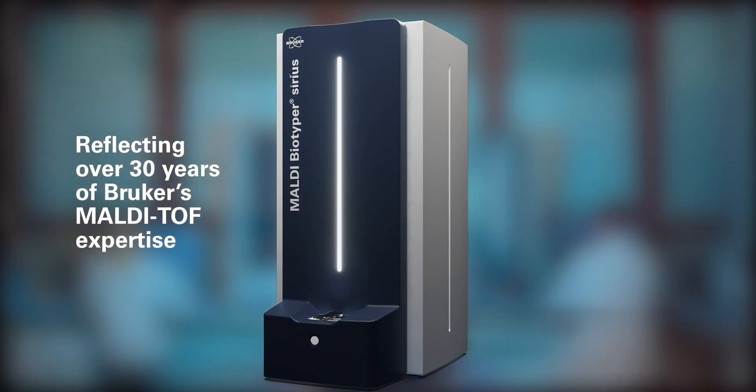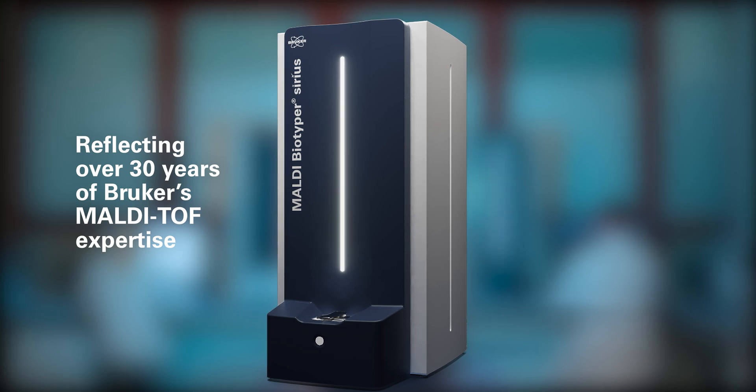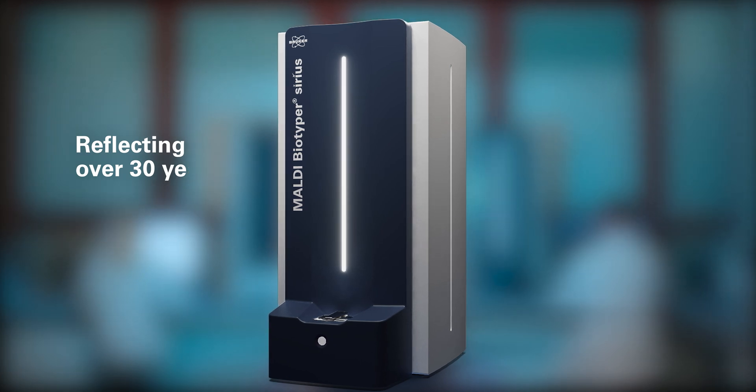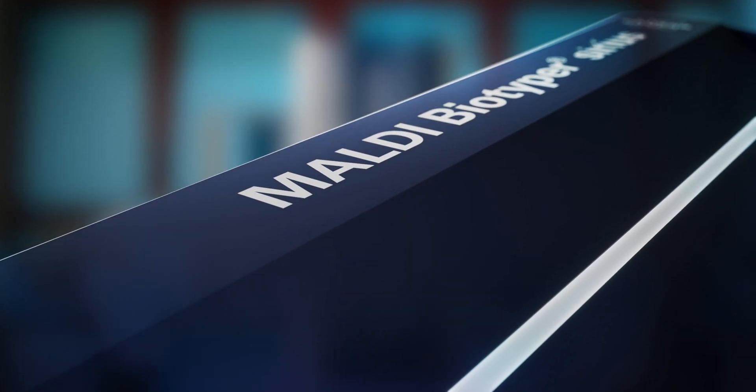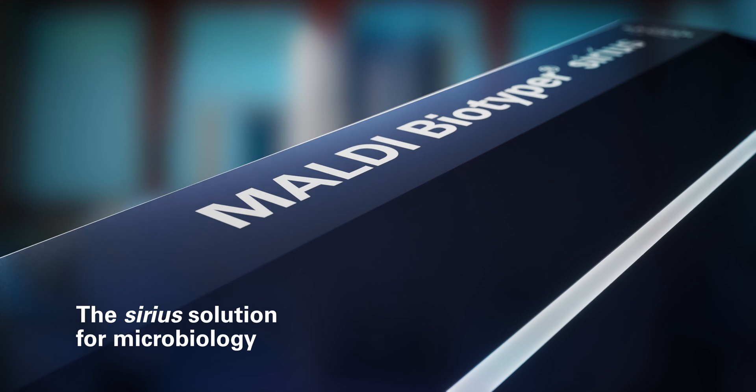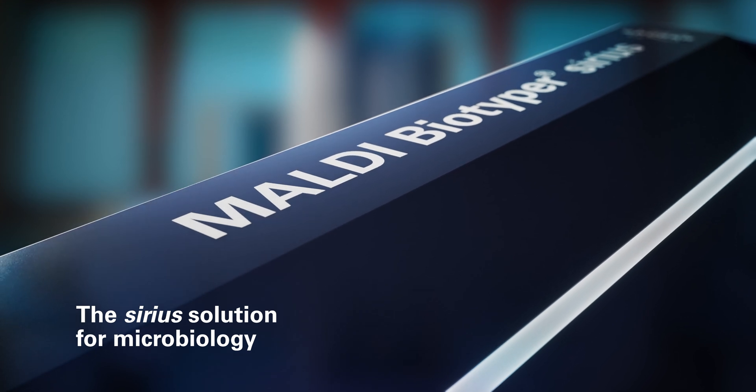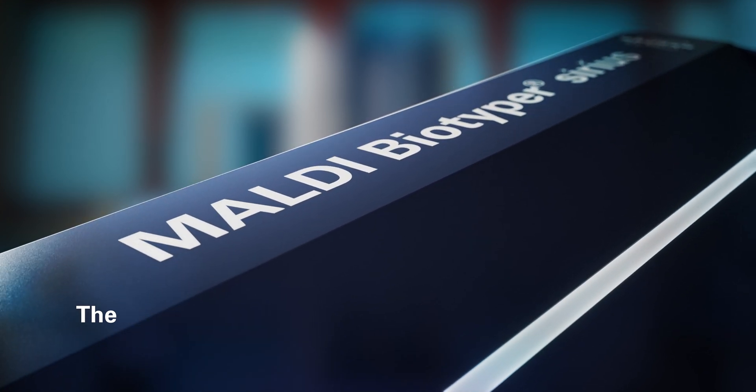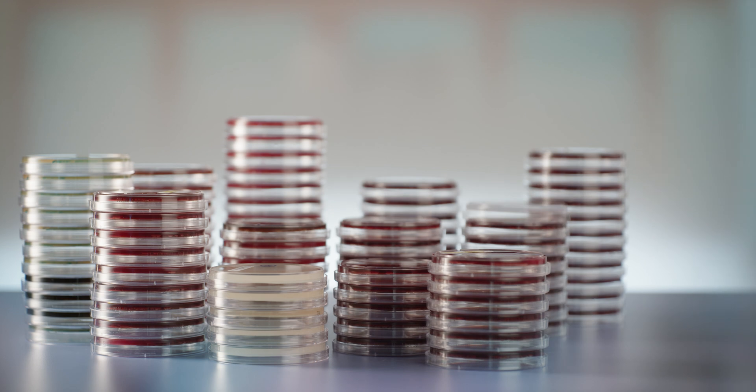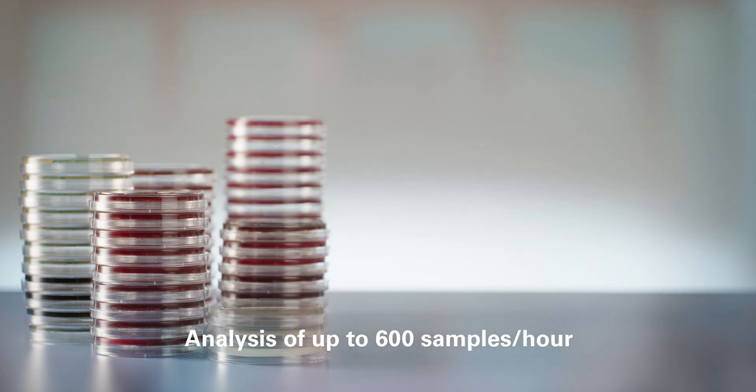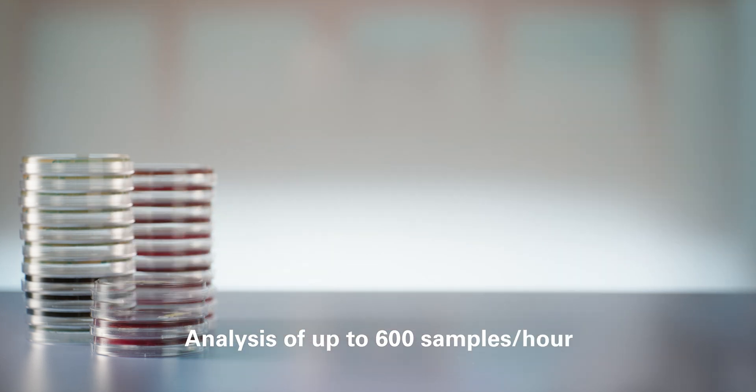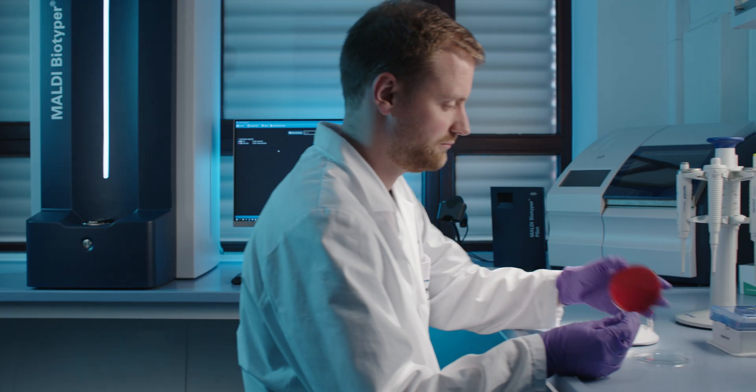Over 30 years of Bruker's MALDI-TOF expertise has been brought together in a compact benchtop instrument, the MALDI Biotyper Sirius system, enabling microorganism identification down to the species level at a pace of up to 600 samples per hour.